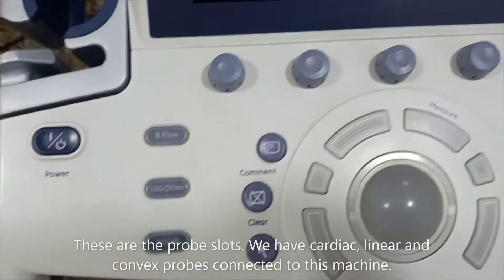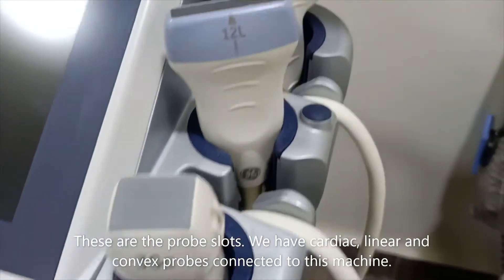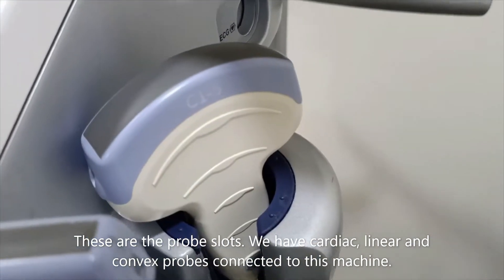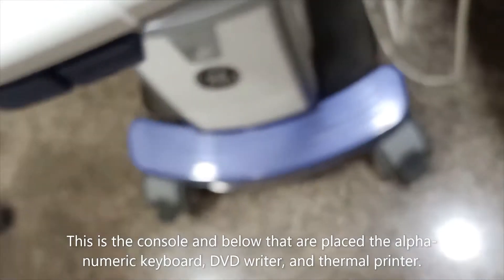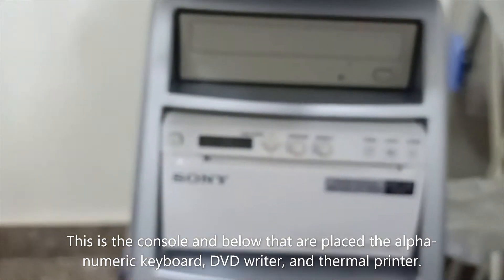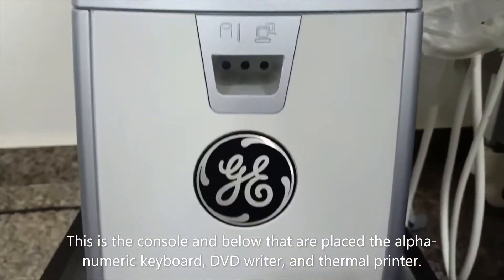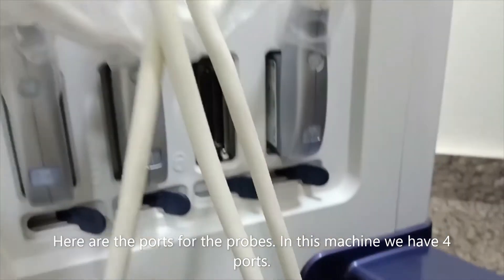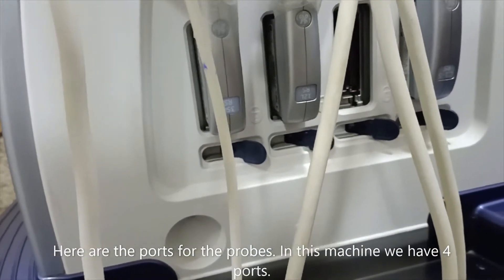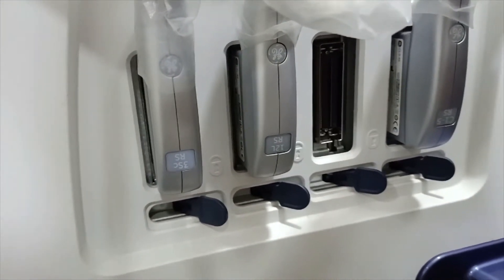Here you can see the probe slots. Three probes are connected in this machine: cardiac, linear, and convex probes. This is the console, and below that you will get the keyboard. This is a DVD writer and printer.